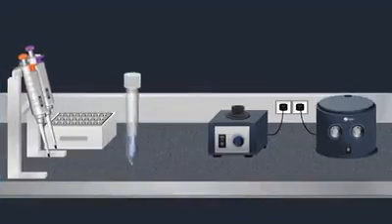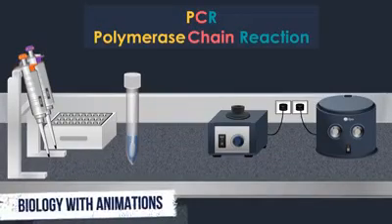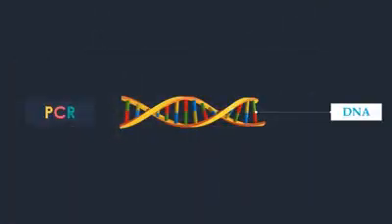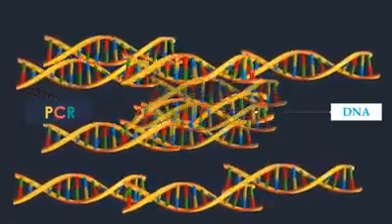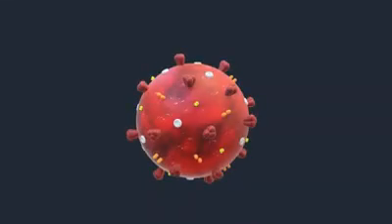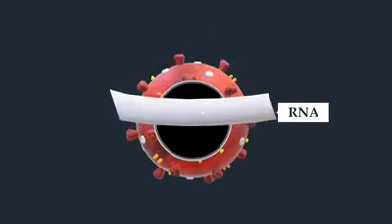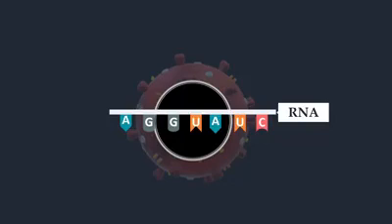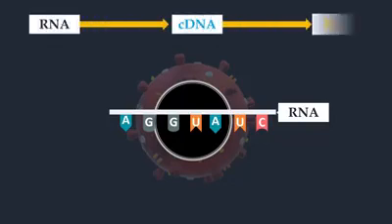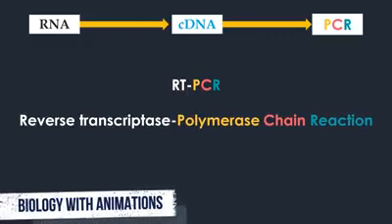The standard method of coronavirus testing is polymerase chain reaction, PCR, which is a method that is used widely in molecular biology to make millions to billions of copies of a specific DNA fragment rapidly. Coronaviruses contain an extraordinarily long single-stranded RNA genome. To detect these viruses with PCR, RNA molecules must be converted into their complementary DNA sequences by reverse transcriptase. Then the newly synthesized DNA can be amplified by standard PCR procedures. This approach is universally known as RT-PCR.